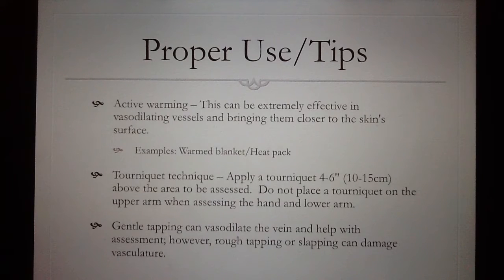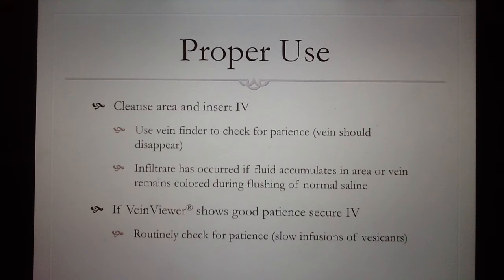Some tips that can help you in gaining IV access are active warming, which is the use of a hot compress or heating pack to help bring the veins close to the skin and dilate them so they're easier to see and palpate. The tourniquet technique is frequently used by applying a rubber band tourniquet 4 to 6 inches above the insertion site. Gentle tapping can also be used to help dilate the veins. Remember not to be too rough or slap the area, because this can damage the vein and compromise it. Prior to entering the patient's room, ensure that you gathered all of your supplies, performed good hand-washing technique, and donned clean gloves.